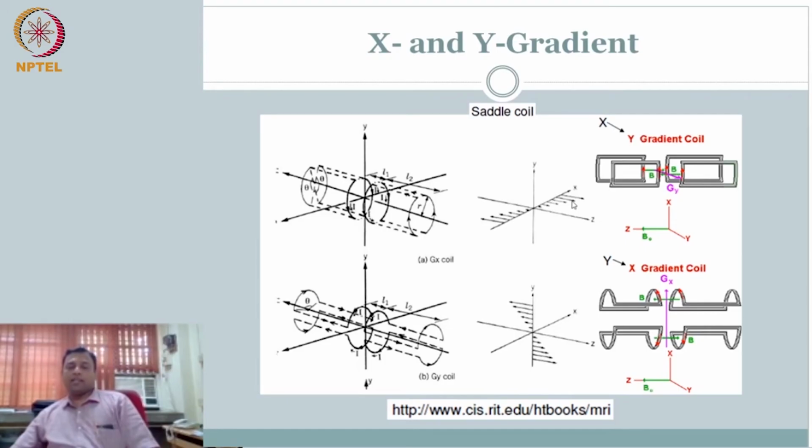And you can see the effect of the gradient, right? The length of this arrow is changing. For any vector, the length is the magnitude, so the field is changing. Of course, it comes to 0. So it is positive, negative, high, becoming 0, increasing, along the X direction. If you use the X gradient, or the Y coil, the Y gradient, the field changes in the Y direction. All the time, notice our B naught is in the Z direction. These are small changes, or gradients, along each axis. This is what the XY gradient coil accomplishes.